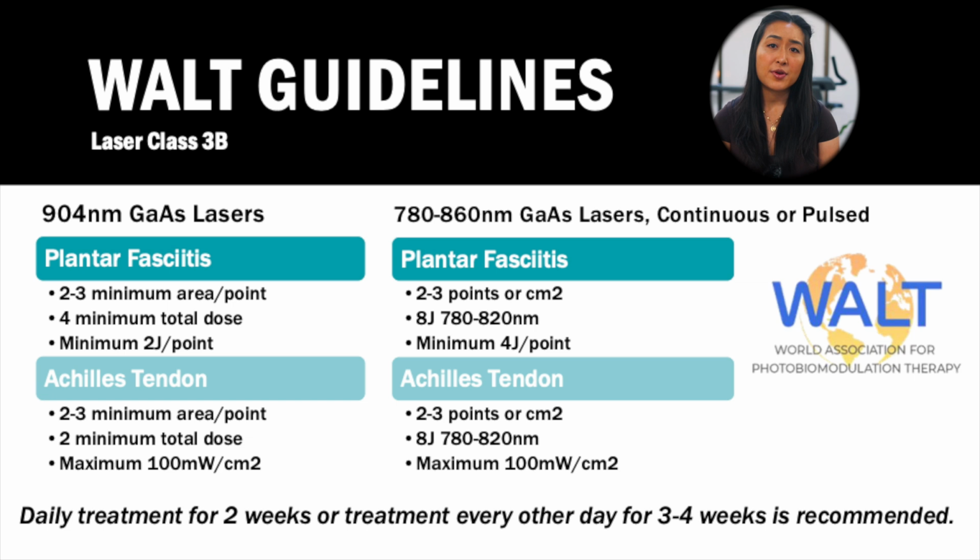The main takeaway from this slide is that daily treatment for 2 weeks, or treatment every other day for 3 to 4 weeks, when using any type of laser therapy is recommended and strongly advised. This statement was written in all of the treatment dosage recommendation documents they have published on their website. Now I want to remind us of the dosage recommendations that were established in the literature for shockwave therapy, which was once a week for 3 to 4 weeks. With laser therapy, it is daily or every other day for 3 to 4 weeks.